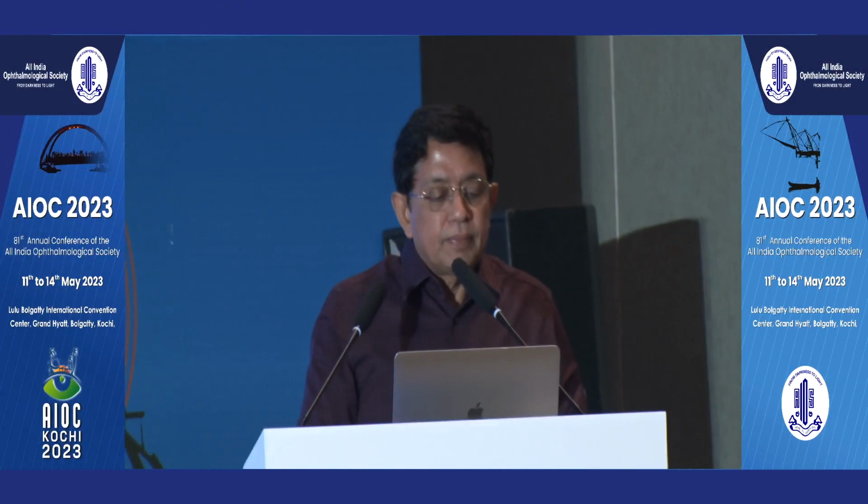Thank you so much, sir, for that master class on toric IOLs. I think the most important lesson that I learned from this talk was to calculate for all eyes, like sir mentioned, because sometimes in a busy OPD you tend to forget whether this is with the rule or against the rule. So don't rely on a value difference between K1 and K2. Don't have a cutoff that if K1, K2 is more than 1, you will consider. Calculate for each eye, and like sir showed in those cases, you'll be surprised that so many of the cases where you had never thought of toric turn out to be T3, T4.